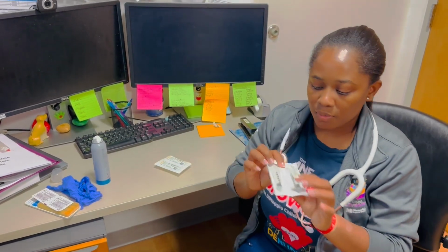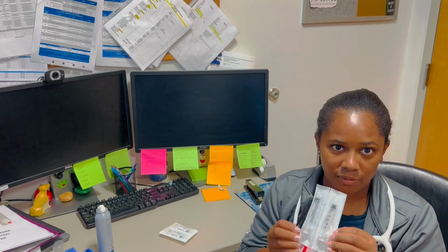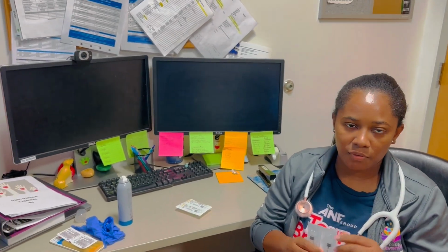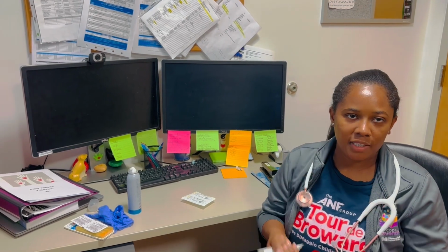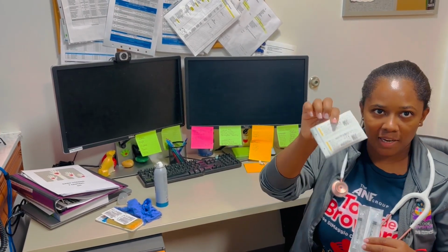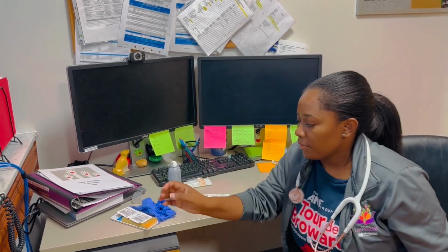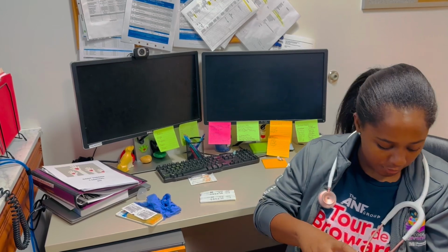I try to use the smallest syringe possible. This one is just a 3 cc syringe. You want to use the smallest one because if you use, for example, a 10 cc syringe, it's way too much pressure when you are trying to give the injection. So you want to use a smaller syringe and make sure that you have the right size needle for your subcutaneous injection. Okay, just like with any procedure, I already told my patient what I'm going to be doing.